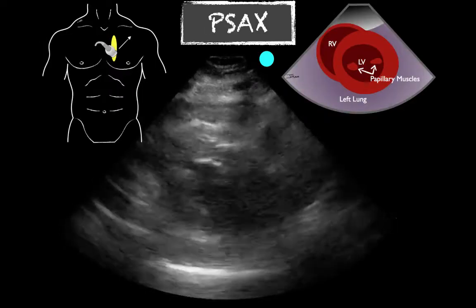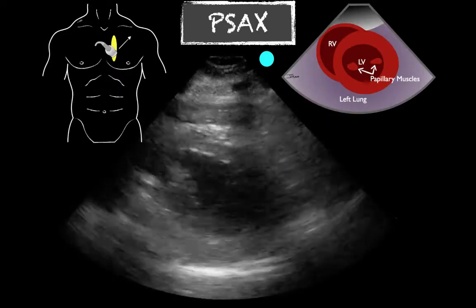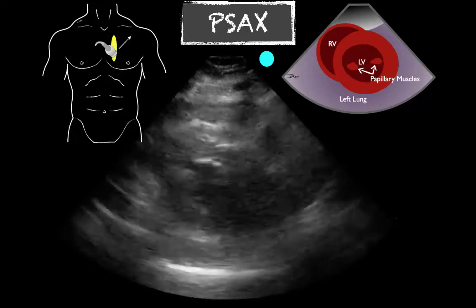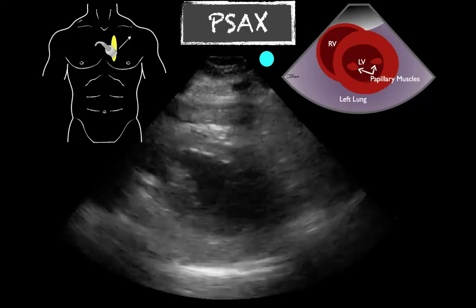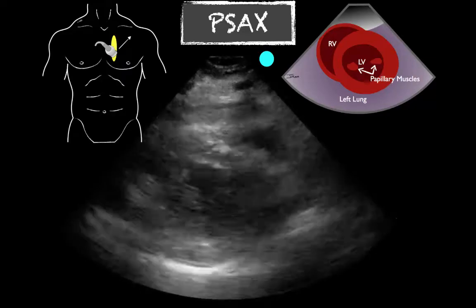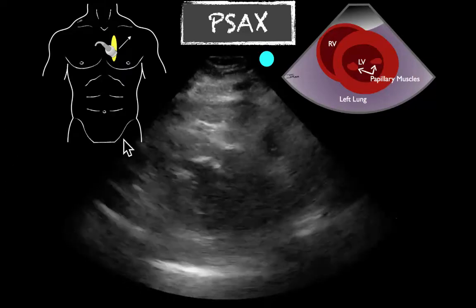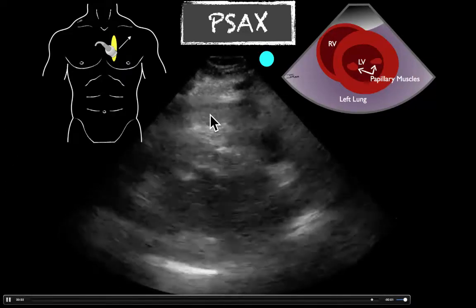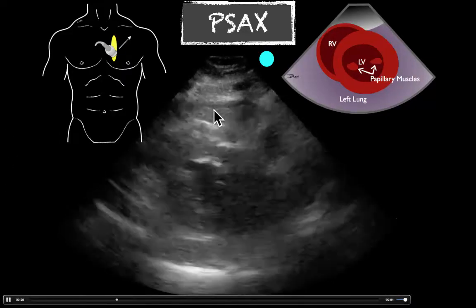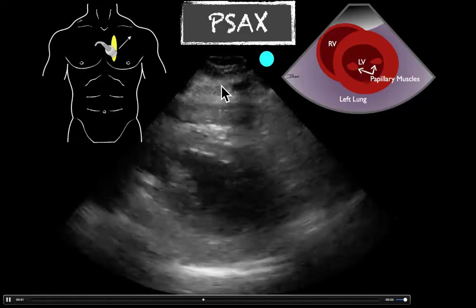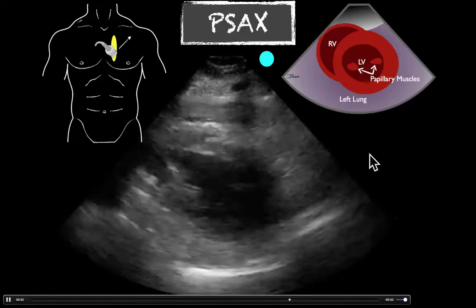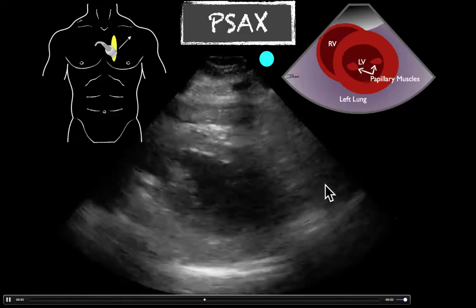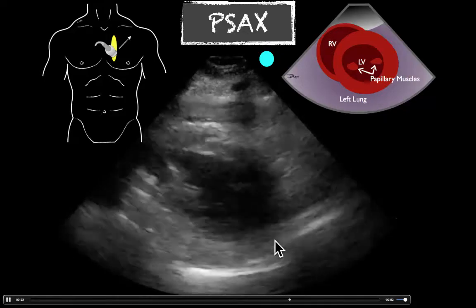Here we're moving on to our parasternal short axis. We've moved our probe orientation. It's a limited view here, but we can again see this area anteriorly, which is more echogenic or isoechoic to the subcutaneous tissue, and again does not appear to be anechoic or circumferential in this case.